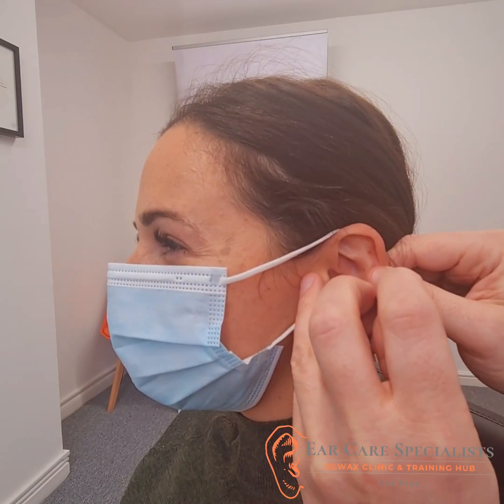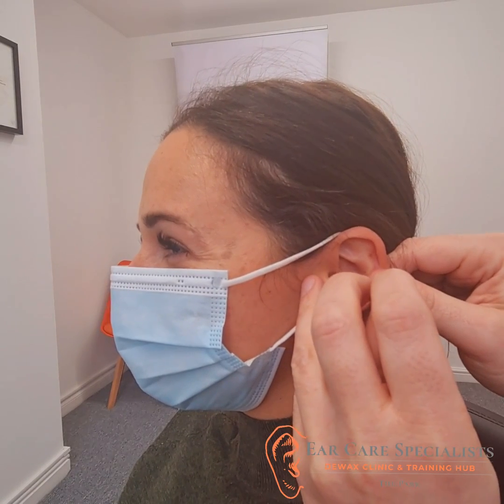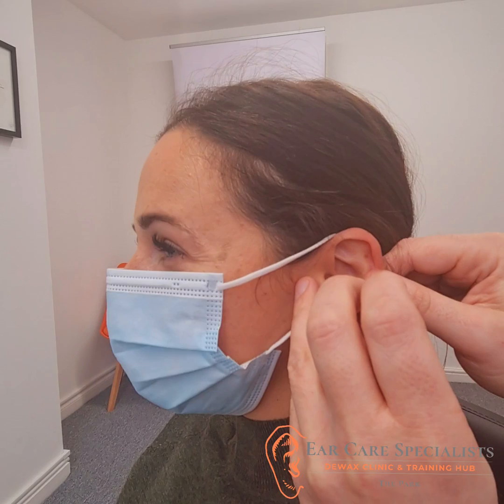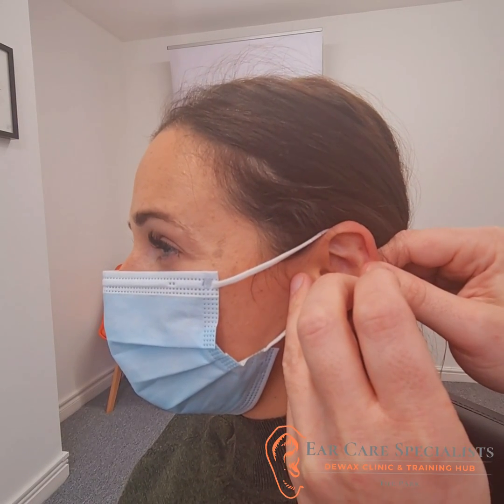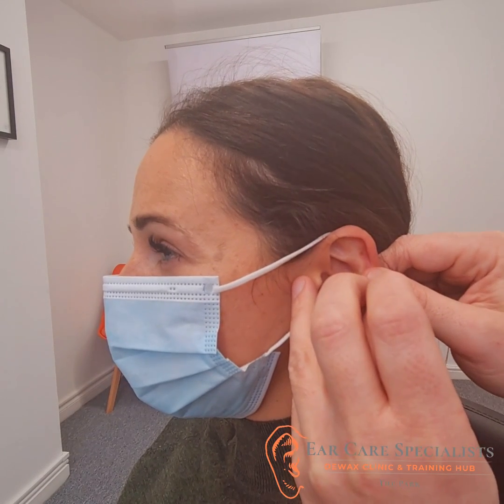Okay, do you feel that bit of pressure? It's not in as deep as it could go safely, but we're going to have a go at pulling it out. I think it's grabbed it — I felt the resistance on the wax.